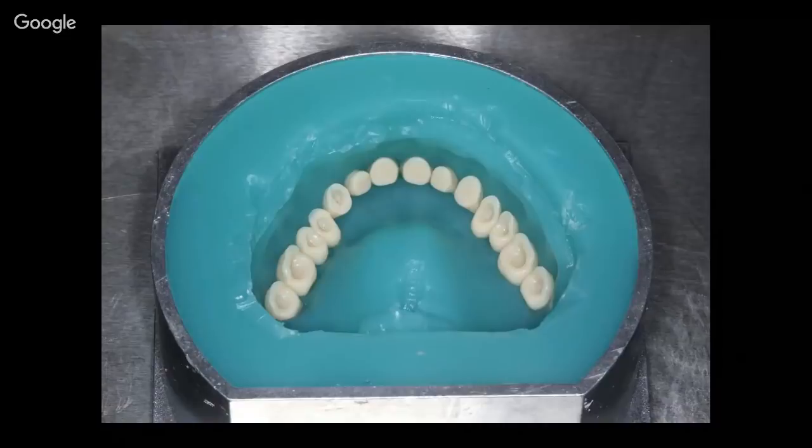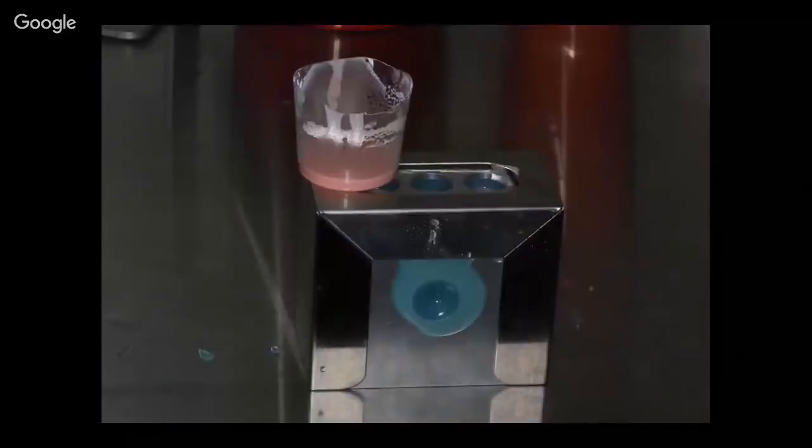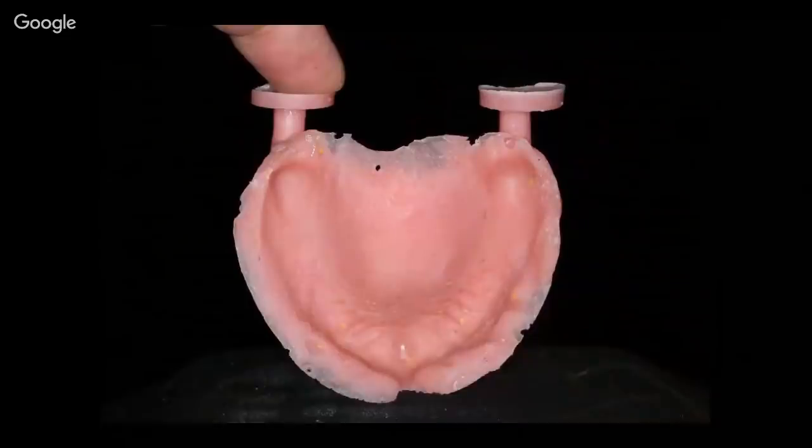Do you see how the teeth have some retention kind of built into their shape? These are those nobilium teeth. It would be wise, again, to put some more mechanical retention in with the handpiece. Close the flask back up, put it back together, and then mix up the acrylic according to manufacturer specifications. There's a number of good pour acrylics, and you'll pour that in nice and smooth until it begins extruding out of the vent holes, which are the ones on the right and the left-hand side.